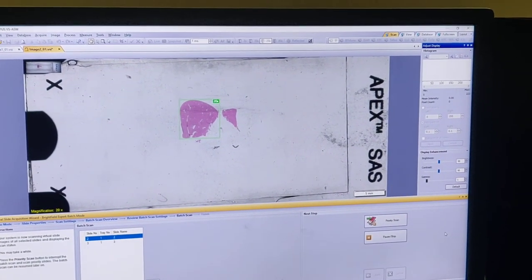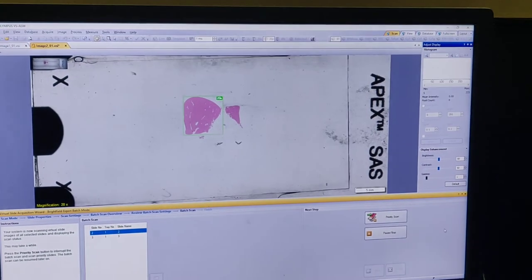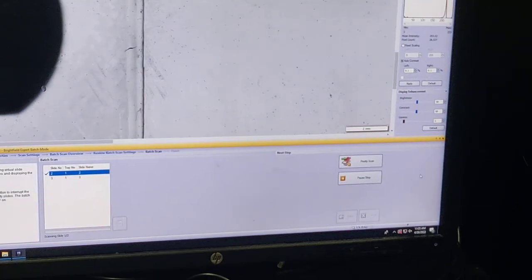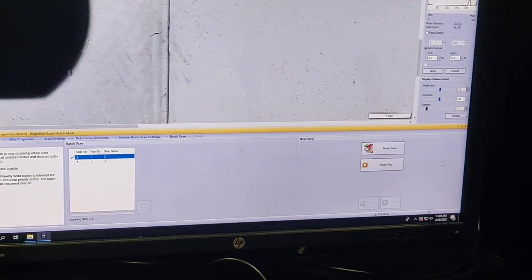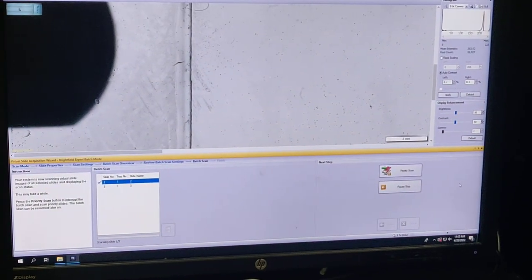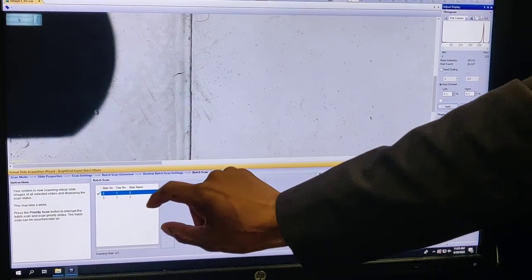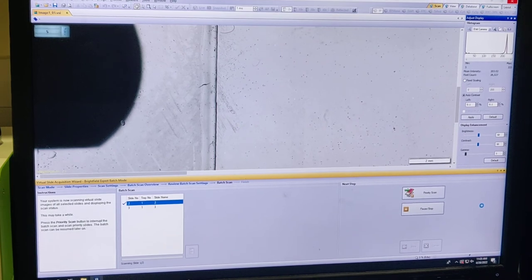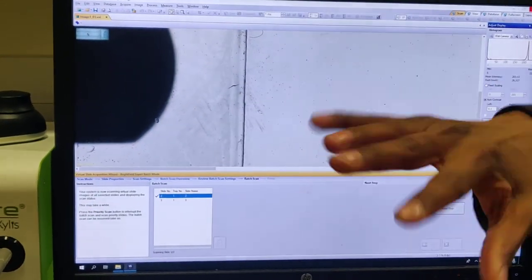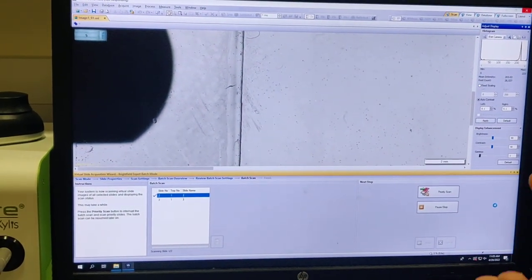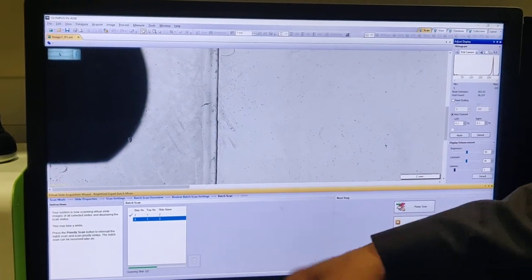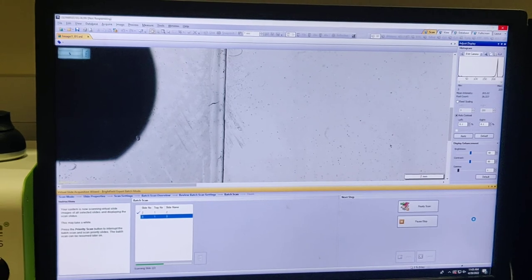Regarding whether you can combine bright field and fluorescence together: yes, you can. There is an option to add multiple scans. However, people rarely do that because instruments designed for bright field are not optimized for fluorescence and vice versa. For rare samples that require both, you can add scans layer by layer.